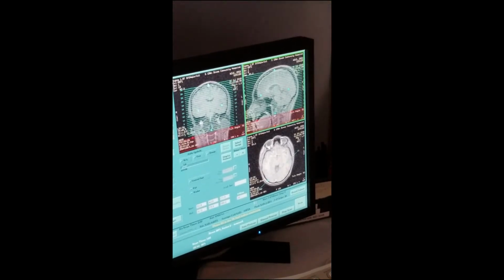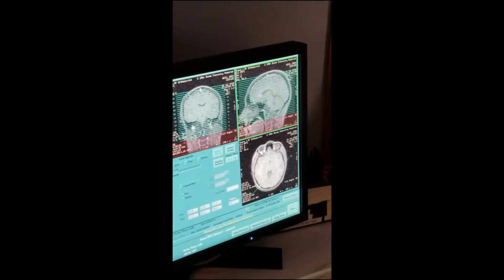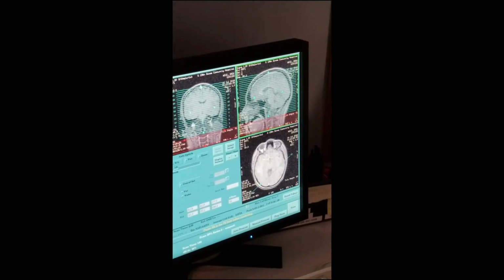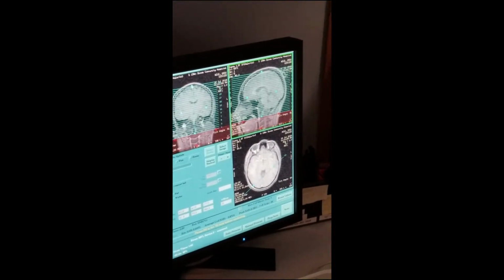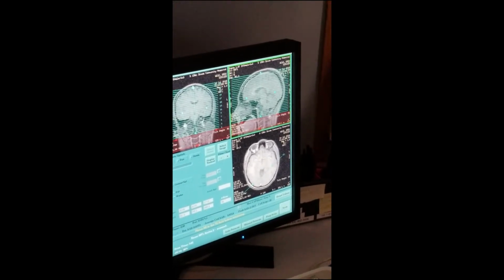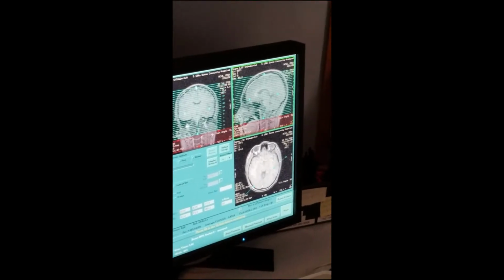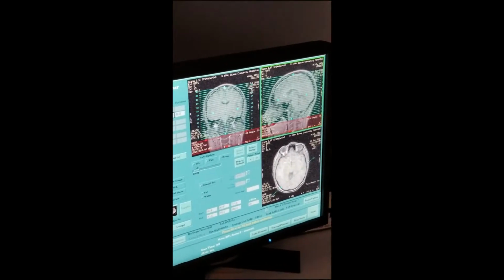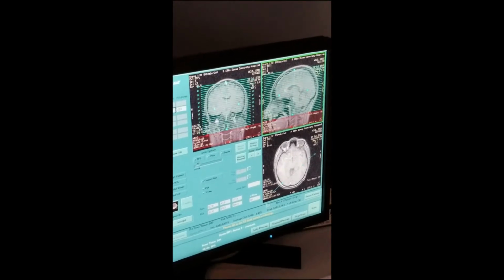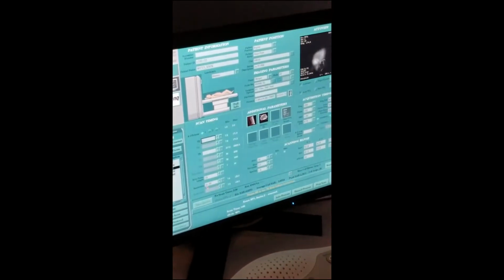Now you do a little bit of adjustment. Because this is angled, you want to angle yourself a little bit. You don't want this way too close. For me, this is good enough right there. Maybe 2 lines. No, that's good. Then you check this, so everything is good. Now what do you do? Accept.